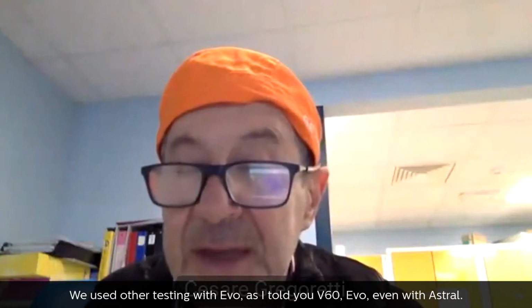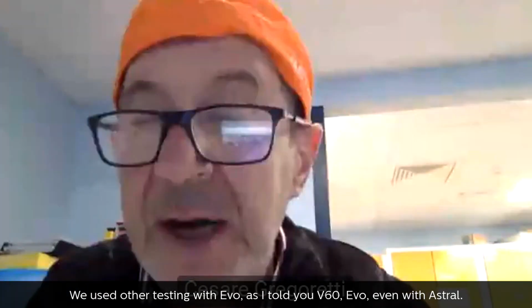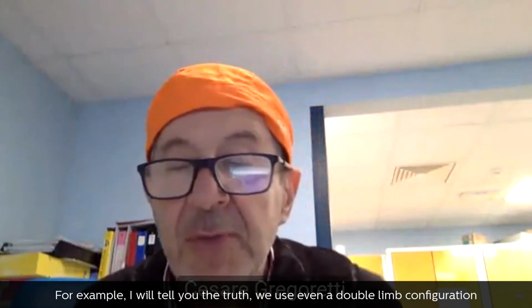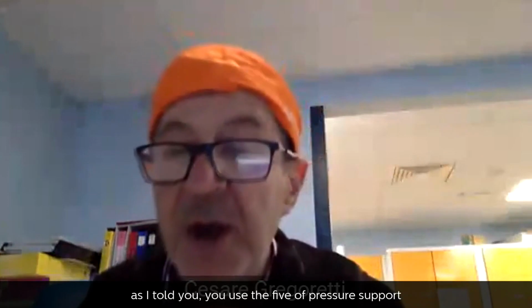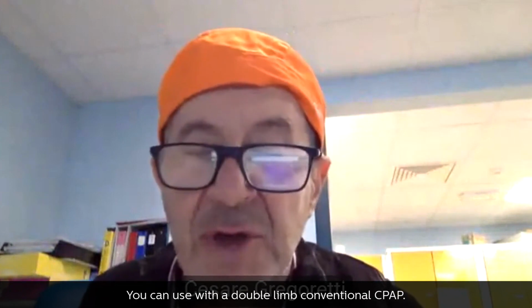We did other testing, as I told you, with V60, Evo, even with Astral. And we also used other configurations. For example, we even used a double limb configuration using, for example, the Astral. But in this case, as I told you, we use 5 of pressure support in order to increase the flow inside the helmet. You can use it with a double limb conventional CPAP.